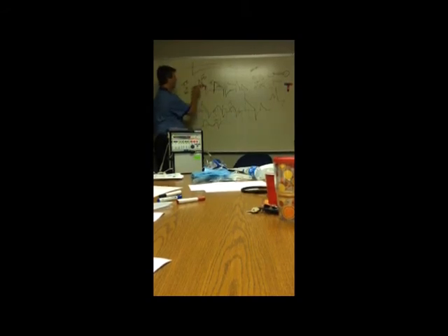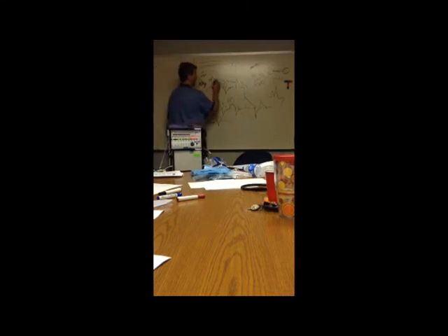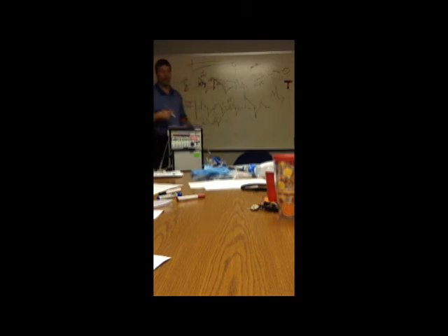So if you get a blood gas on volume ventilation and you don't make much changes, chances are it's going to stay about the same. If their lungs get stiff, they're still going to get that volume. Their peak pressure may go up or down if their lungs get better, but you know they're going to get 500 every time. In pressure control, which takes more monitoring because things change, you're going to get the same pressure every time. If they start getting wet, their tidal volume is going to start going down.